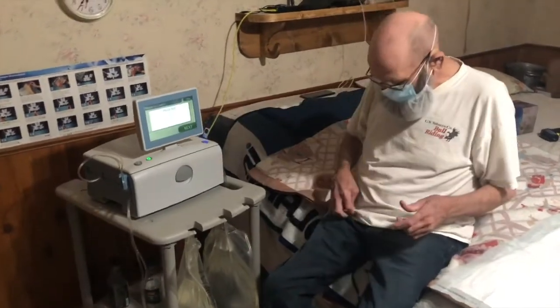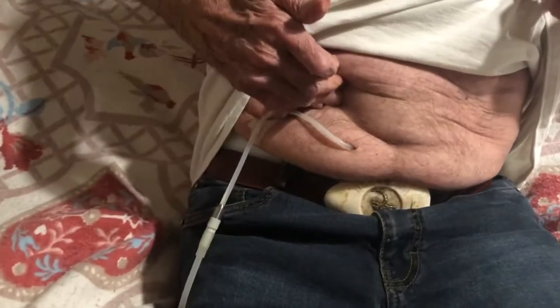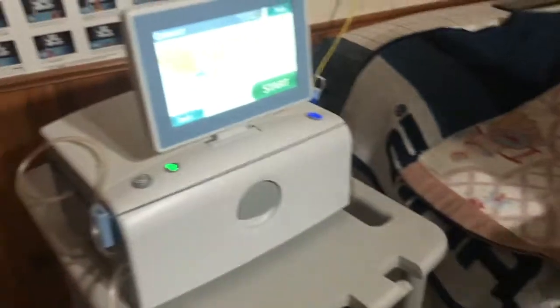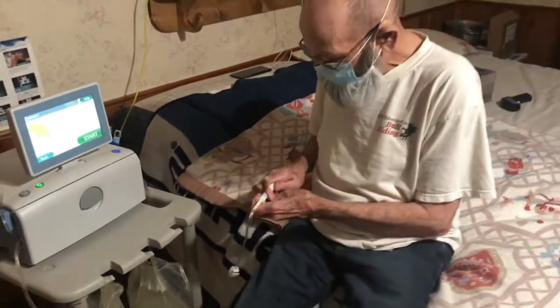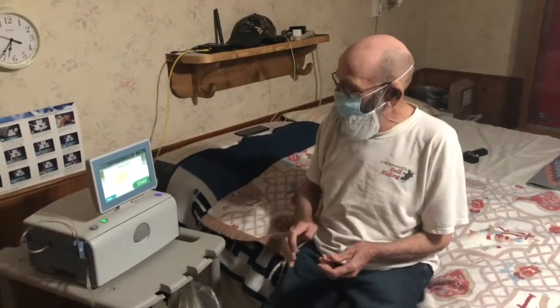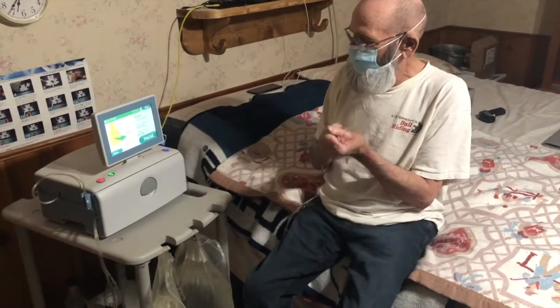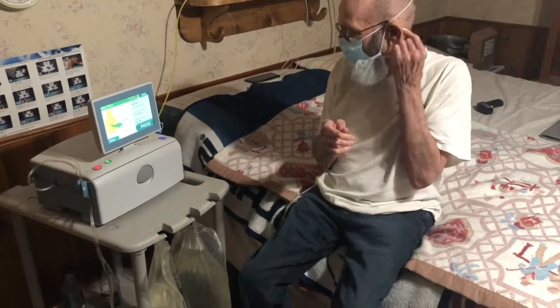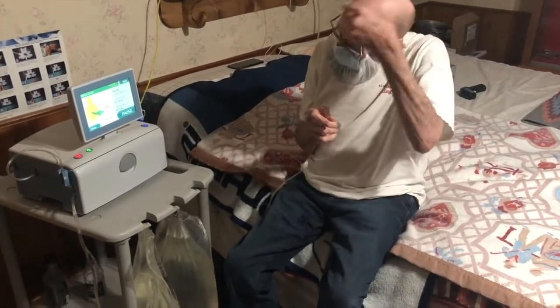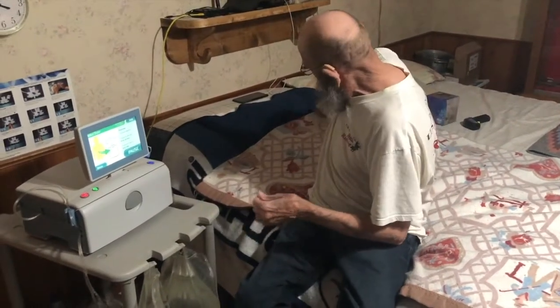Now, you want to look at my site. Make sure it's good, clean. Open transfer set. That's it. Then you open this up. Turn this on. And we're ready to roll. The dance starts. And now we can take our mask off because we're all hooked up. No danger of contaminating anybody now.